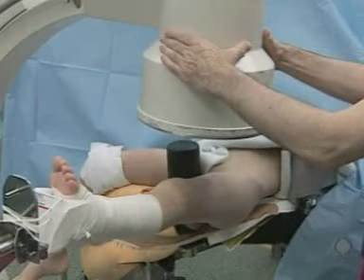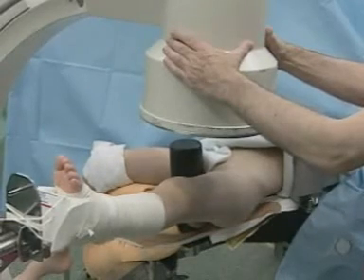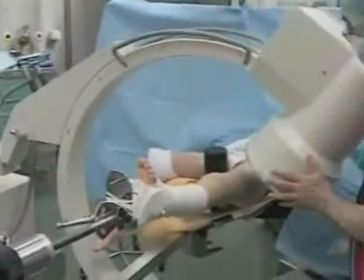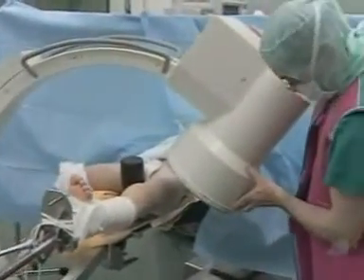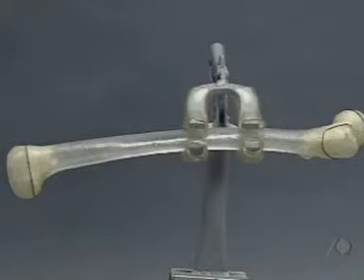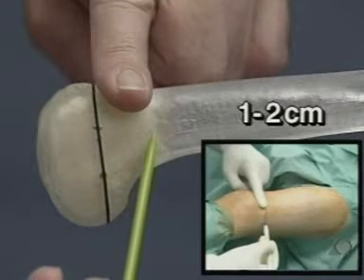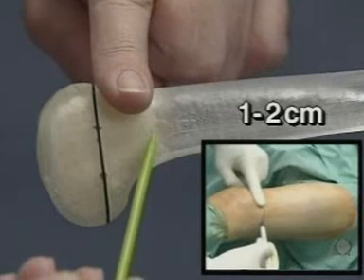With transverse fractures, it is particularly recommended to work on the extension table. Preliminary reduction is carried out under the image intensifier, positioned so that even with sterile covering it allows radioscopy of the whole leg. The isthmus of the medullary cavity is measured on the x-ray image; the diameter of each nail should be 30 to 40% of the diameter of the medullary cavity, and nails with identical diameters must be used. For the ascending technique on the femur, the insertion points are 1 to 2 cm proximal to the distal epiphyseal plate — about the width of one finger proximal to the upper pole of the patella — and should be checked under the image intensifier.